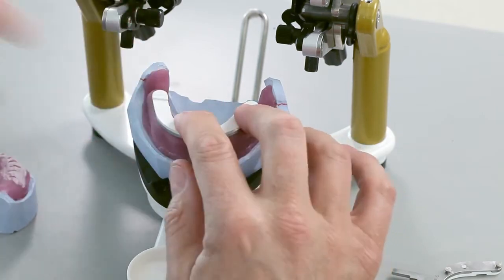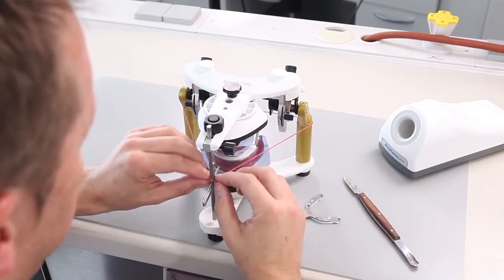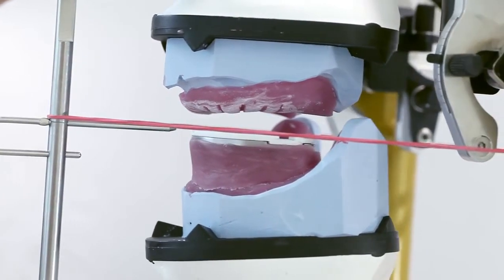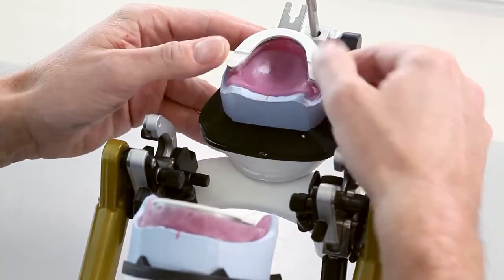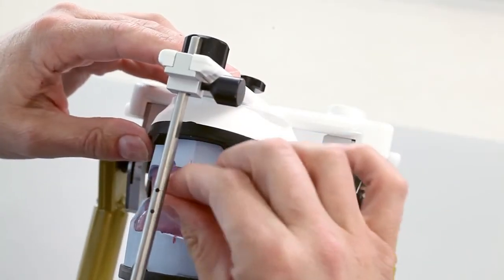Then align the prepared lower rim with the occlusal plane using uncured tray material. Take the anterior midline and the defined retromolar pads into consideration. Polymerize according to the manufacturer's instructions. For the maxilla, the gnathometer M is mounted in such a way that the white bite plates close parallel to the mandibular arch.